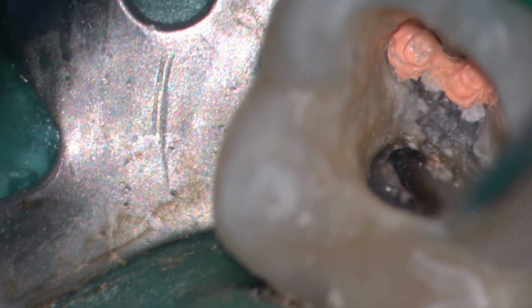It seemed like a limited area of involvement. So I packed that off solidly, sealed it, and the Biodentine is going to be placed in the peripheral larger communicating opening. Now, why was this area perplexing to me?